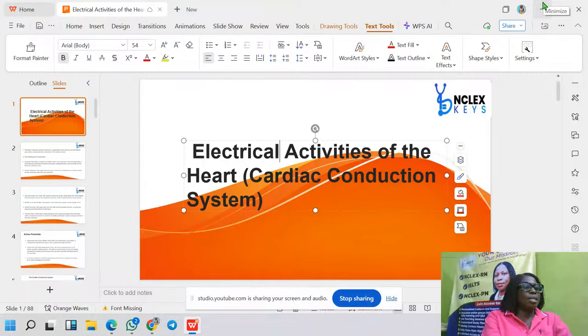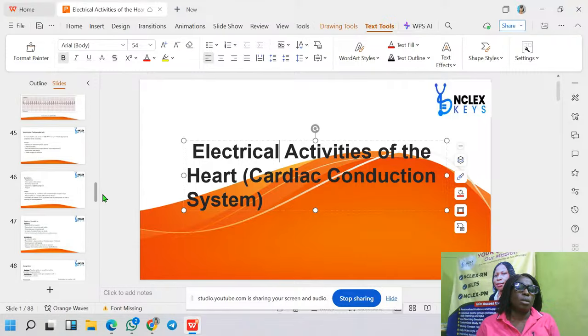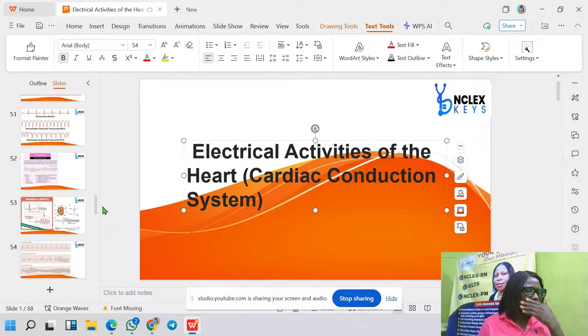The big heading is premature beats. You will now bring it into two places. It can be premature atrial contraction. It can be premature ventricular contraction. I said that both of them can be affected with premature beats. But for the exam, please make another two lines under premature ventricular contraction, meaning bigeminy 1, trigeminy 2. So are you done with the sketching? Have you sketched?